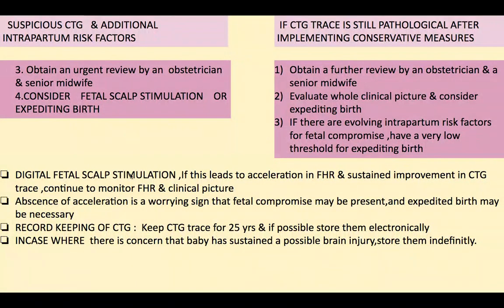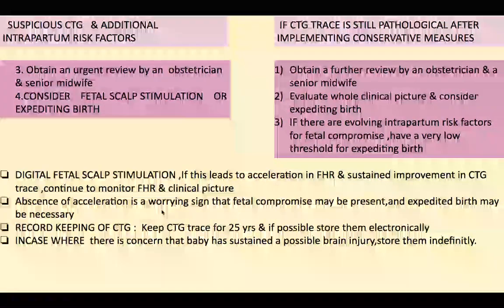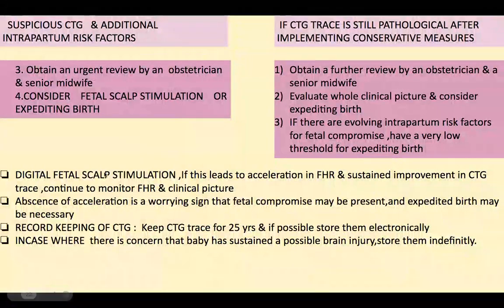We have done the fetal scalp stimulation, and then we will see the result. If it leads to acceleration in the fetal heart rate and improvement in the CTG trace, we will continue to monitor the fetal heart rate and the clinical picture. We are not going to do any intervention. But absence of the acceleration is a worrying sign that fetal compromise may be present and expedited birth may be necessary, right? So this is a very important point and it only comes in this scenario.